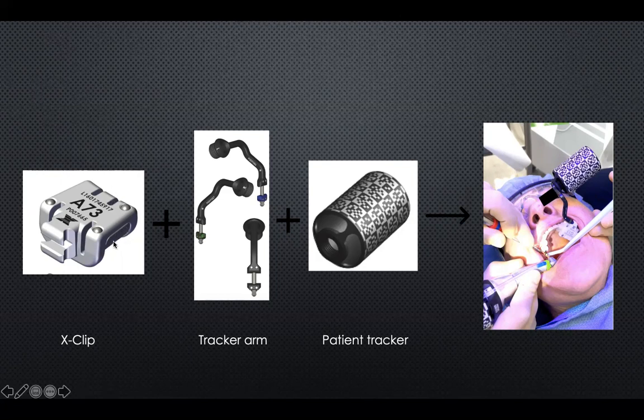So this material changes from solid to moldable, and then you put it on the teeth and you press it around the teeth. You have to position it on the same arch where your future implant is going to be. So if you're placing an implant on the upper or on the maxilla, you have to use one for the maxilla. If you're planning another implant for the mandible, you have to use another clip for the mandible.